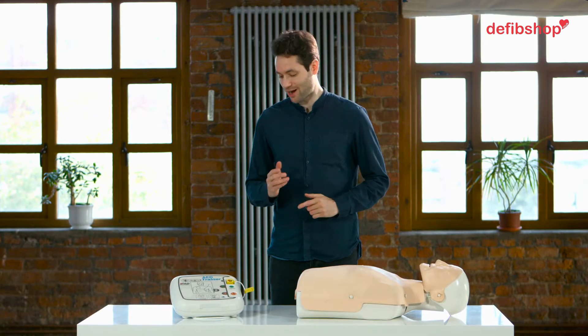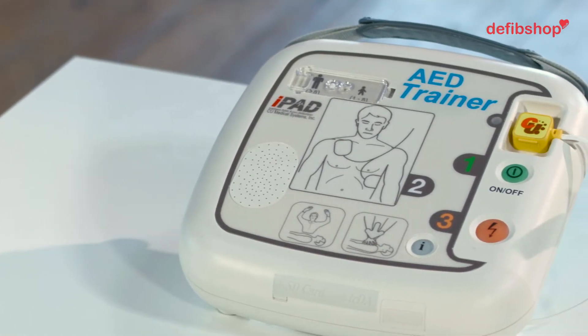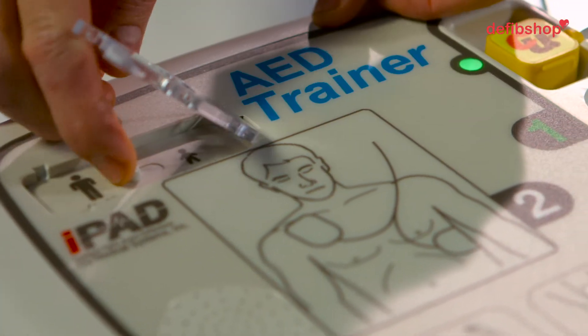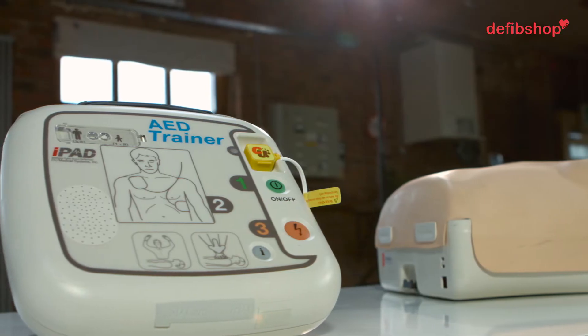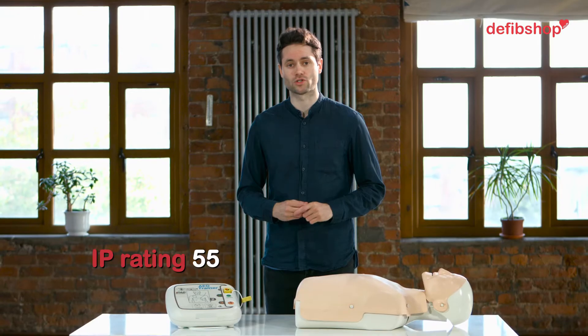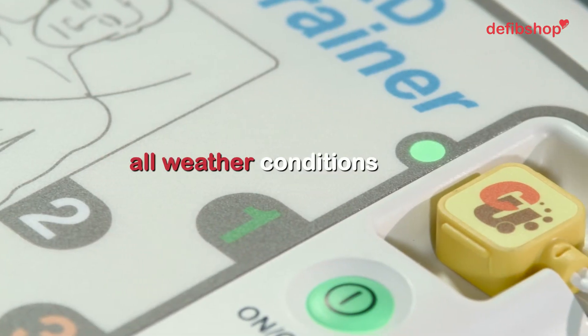The CU Medical Systems iPad SP1 has stylish features, a sleek design and innovative technology, which is why it's so popular with our customers. It also has clear and helpful diagrams. It has an IP rating of 5.5, which means it has a good resistance to dust and water, making it perfect for all weather conditions.